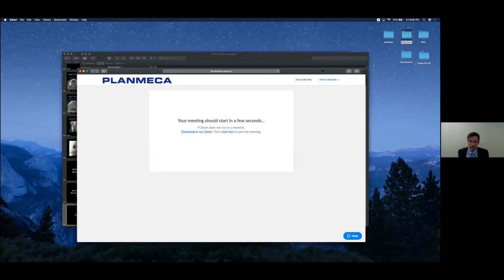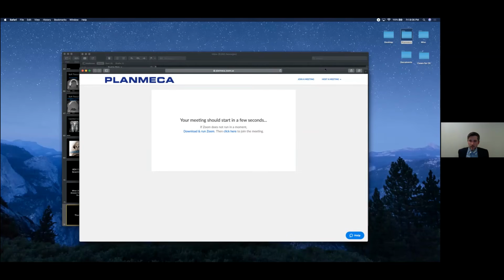The best answer, with regards to scanning every patient: if you have a cone beam CT machine that has a low dose option and you're able to collimate that field of view to just the maxillary mandibular dentition, the dose should not be greater than a panoramic.